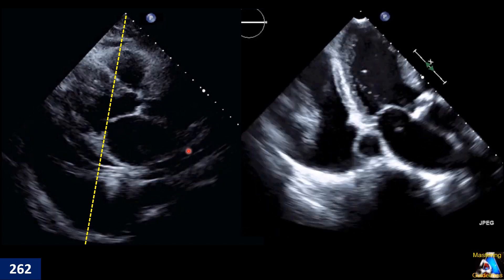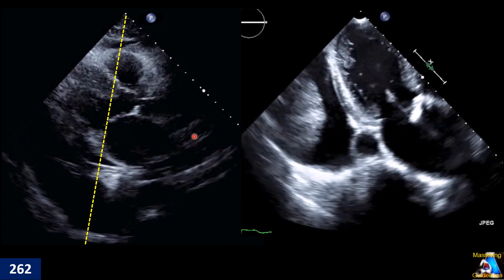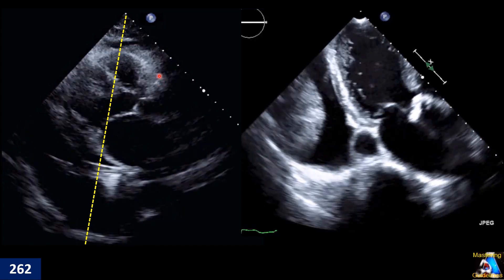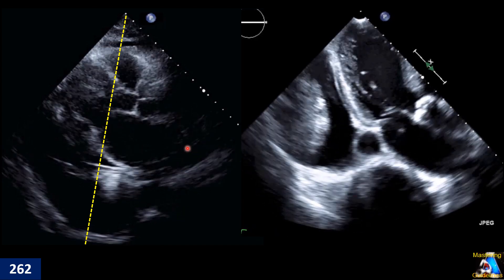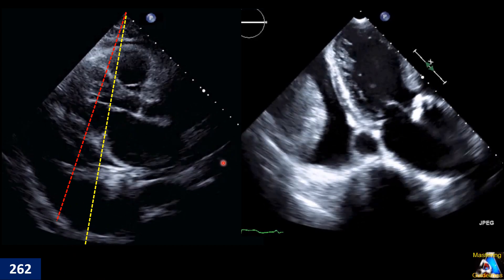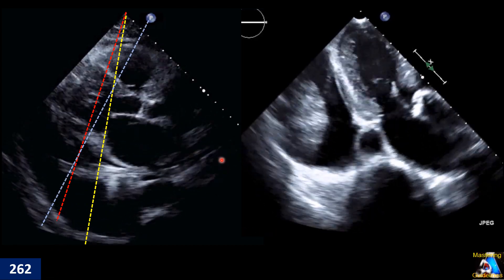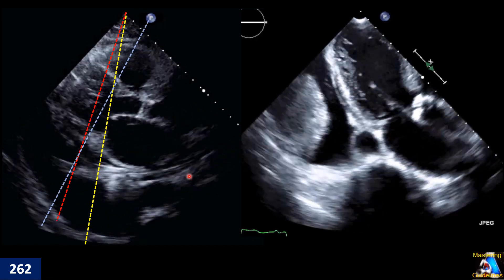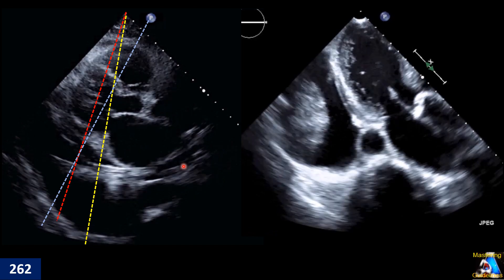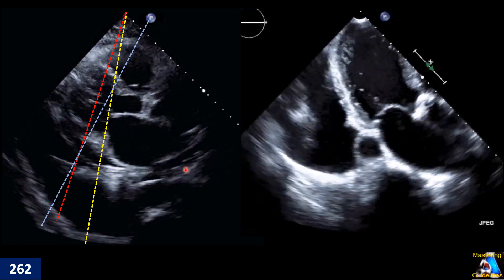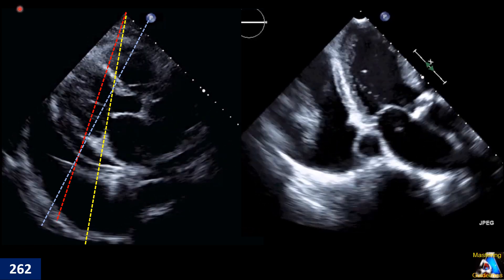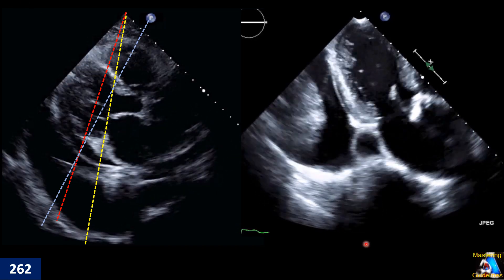I am going to answer a little later: which cursor placement is correct for M-mode? This one? This one? Or this one? And why? Also, why do we measure — just for grading, or something else?